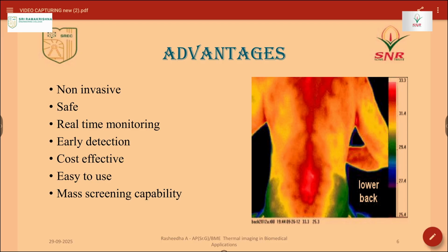In those cases this thermal imaging played a vital role, and it is playing a vital role in mass screening also. It is a non-invasive and painless method. It makes it comfortable for the patients, obviously, and it is radiation free. It can be safely used multiple times without any kind of high health risks.